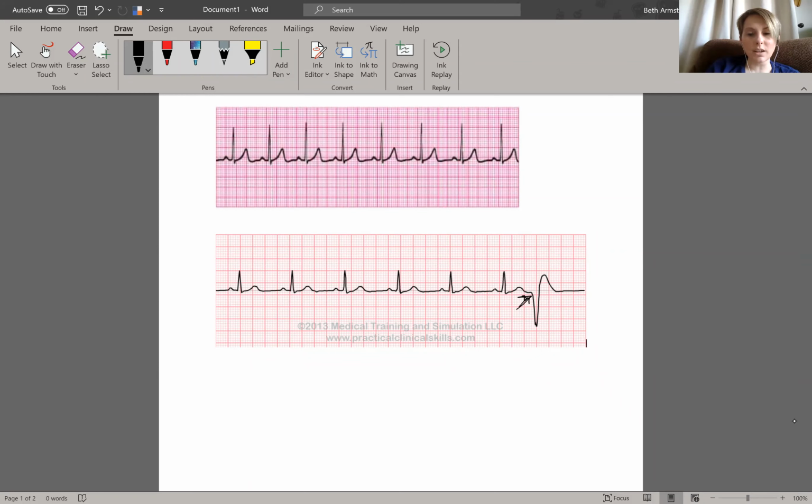And so all of a sudden, the ventricle, so this is your QRS right here, goes, nope, I'm cutting the atrium in line, and shoots out its QRS. That's where it goes ventricular premature. It prematurely cuts in line. So that's what it looks like.